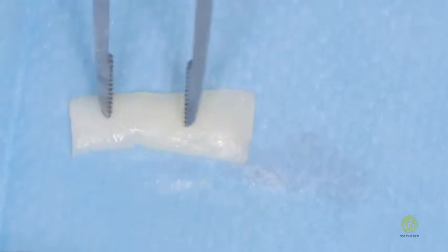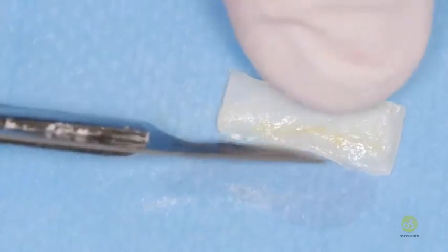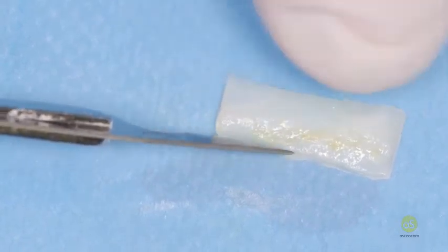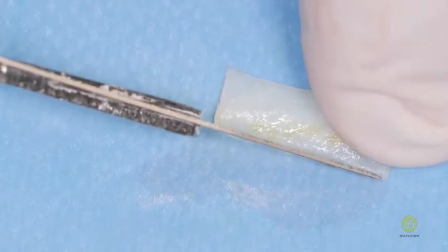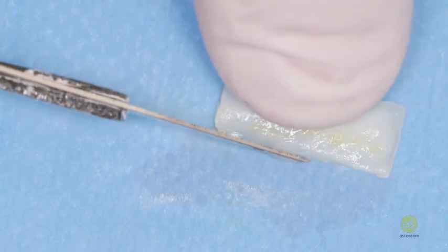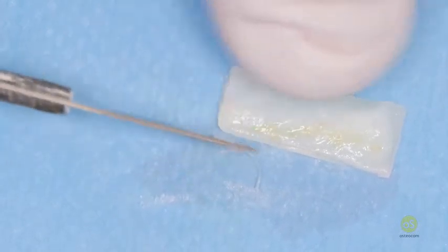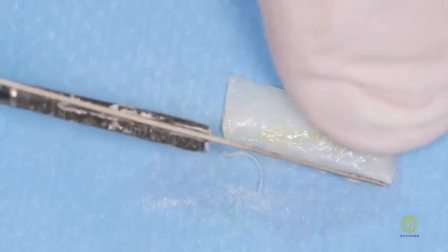Now I want to check also inside if there is some area of epithelium, and you can see that there is epithelium here all along. It means that when I did the apical incision connecting the two vertical incisions, it was not exactly perpendicular. I beveled also this incision, and so this area of epithelium must also be removed. So now we have good quality of connective tissue everywhere.